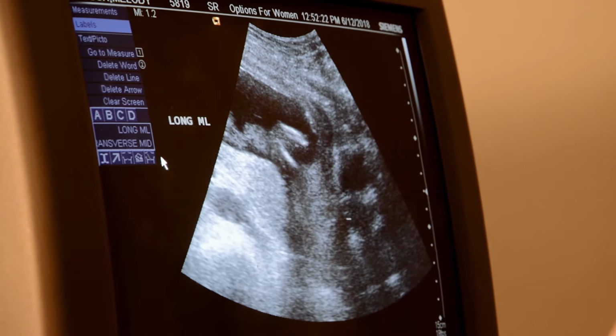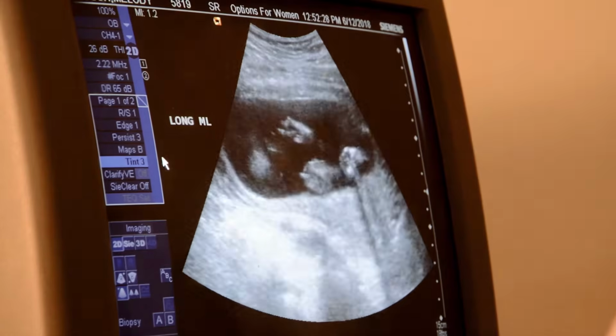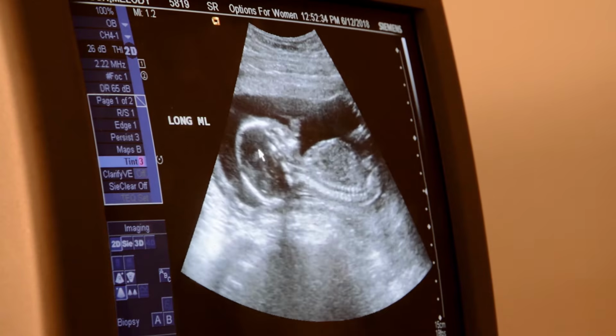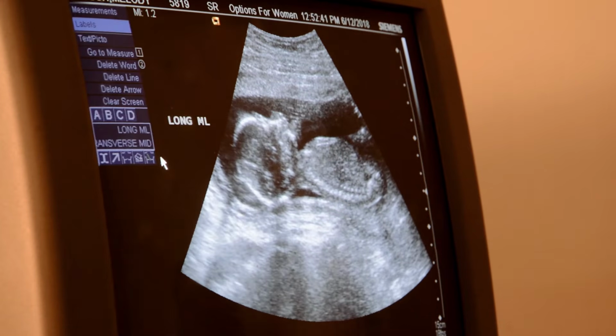So that's your sagittal view, and then you unfreeze, and then we look here and we see a baby. And baby's laying on his back. It's a beautiful profile shot right there. Let's give that a picture of mom.